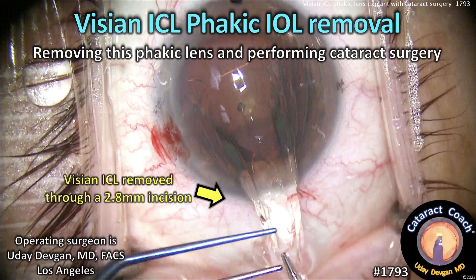CataractCoach.com. Visian ICL, Posterior Chamber Phagic IOL Removal.